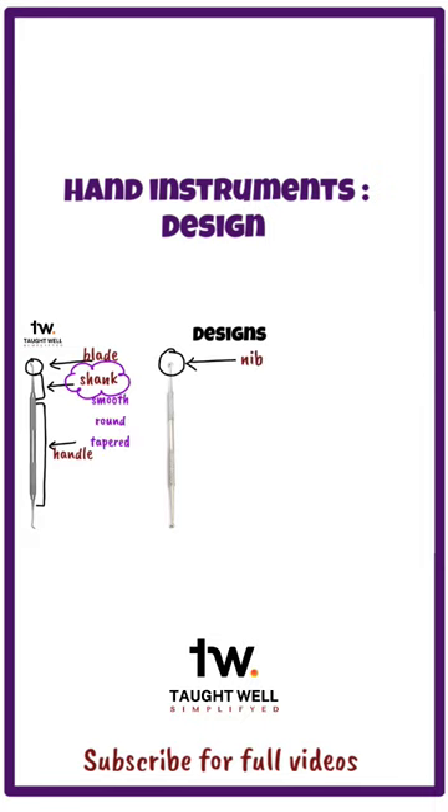Shanks are normally smooth, round, and tapered. They may be straight or angled. Angled shanks help in the accessibility and stability of the instrument.